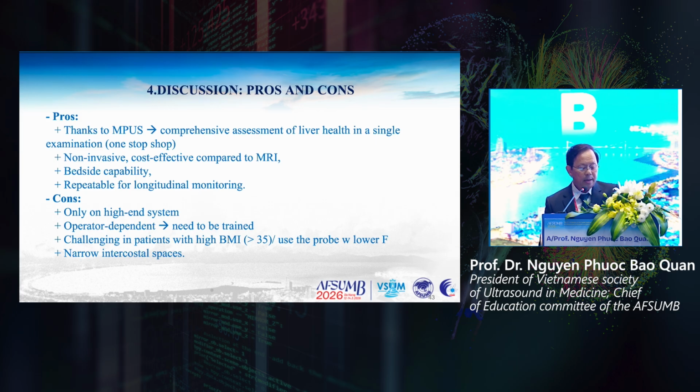But multiparametric ultrasound also has disadvantages. The technique is only available in high-end systems. So I think in the future, manufacturers can bring these functions and technologies to low-end or medium-end systems.